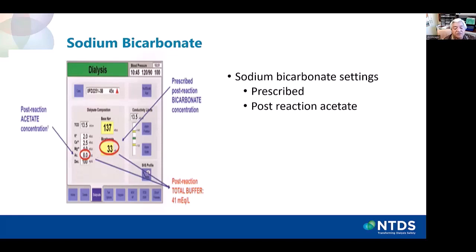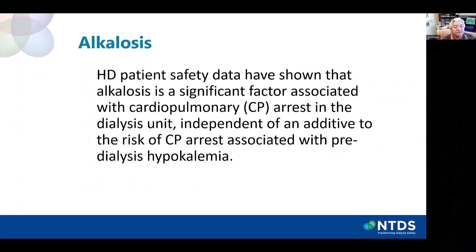Is the physician ordering what the total patient base load experience should be, or how the machine program should be set? Or should clinical staff know to compensate for the acetate base load and adjust the sodium bicarbonate program accordingly to deliver the physician's prescription? Dialysis staff and physician must be in harmony between prescribed versus machine setting. This is a result of physician and dialysis staff not being in harmony on setting versus base load.